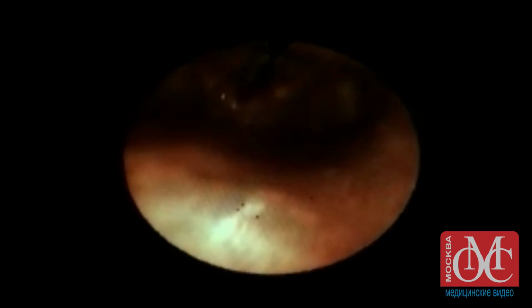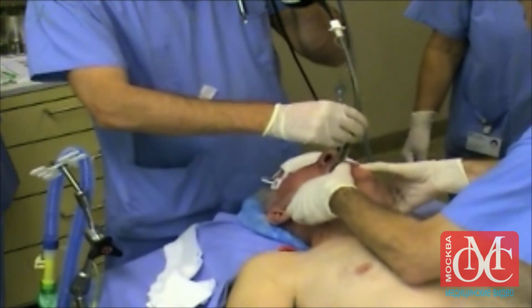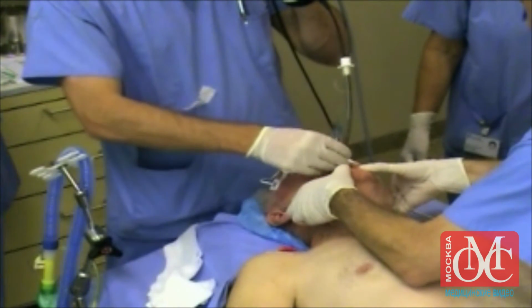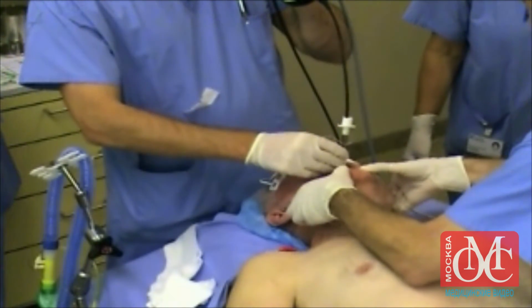The end of the epiglottis can be easily recognized as you proceed. Advance the fiberscope through the glottis just above the carina, as demonstrated previously. When the insertion of the fiberscope has been completed, remove the slit oral airway and advance the flexible tube using rotating movements while maintaining the chin lift and jaw thrust maneuver.